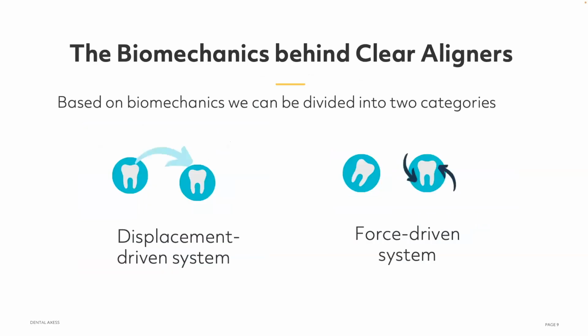Now we are going to see some biomechanics behind clear aligners. So it's very important to understand how the teeth move. That is why in this seminar, it is very important to have this knowledge first, because at the end, we are going to have an orthodontic treatment plan. We are going to move the teeth. We are going to change the patient's bite. So because of that, we need to understand how the aligner works, and how the teeth move.